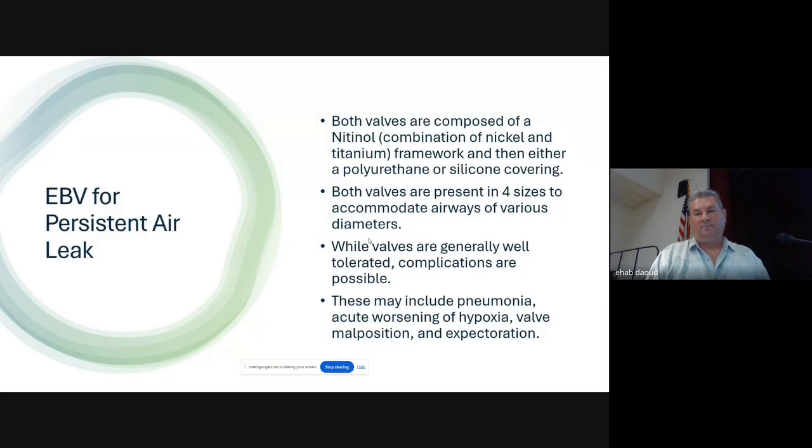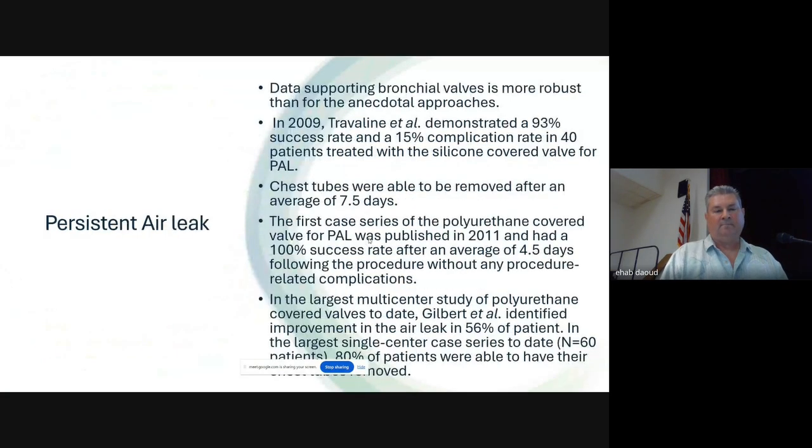Like I said, they're both made of nitinol. They have different coatings. They come in various sizes. Pretty easy to deploy, low complications. I've never seen one migrate, but I guess they could. And you can get pneumonia behind them. Sometimes you deploy them and it doesn't land right and you have to reposition it or take it out and do another one, so not always easy. Plenty of data out there to show that these things do reduce the time of the air leak and get the chest tubes out faster.